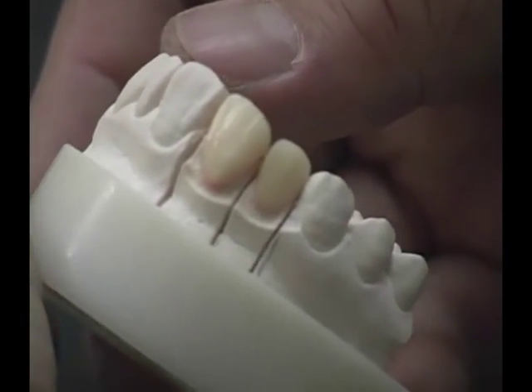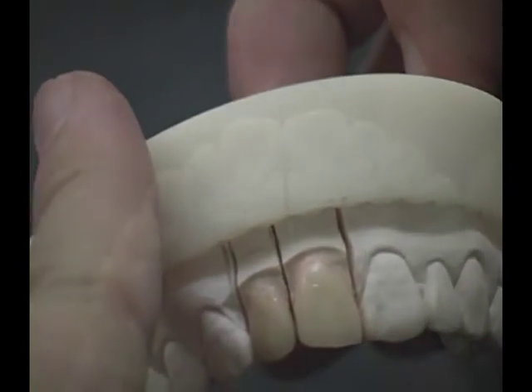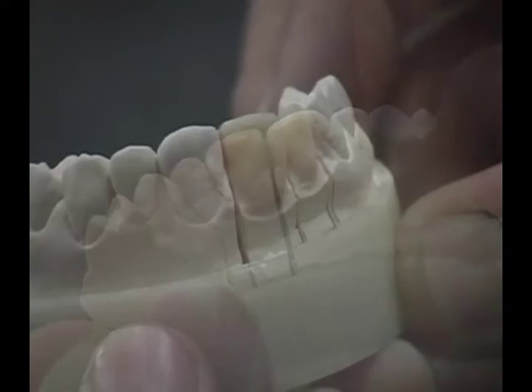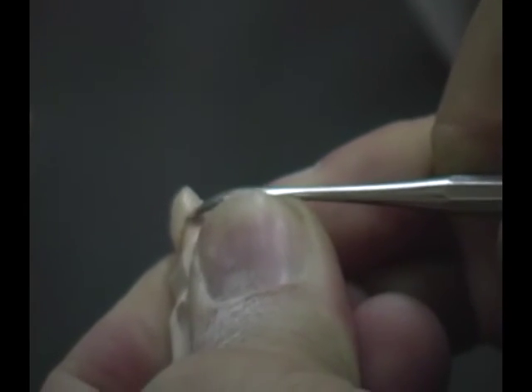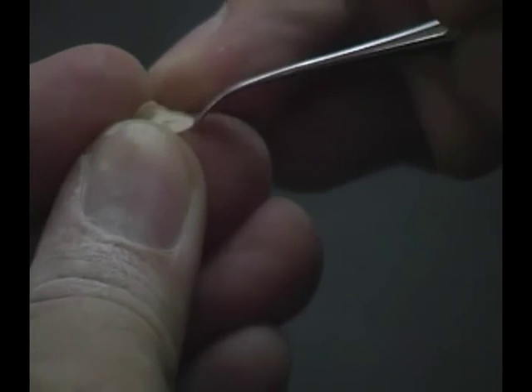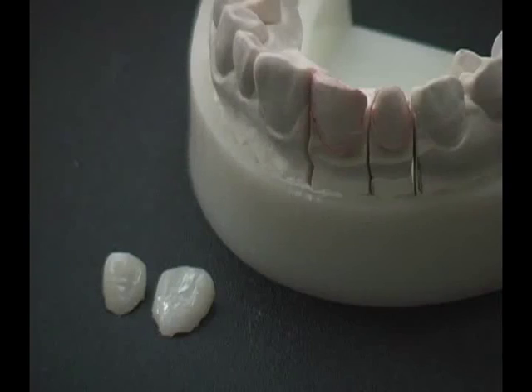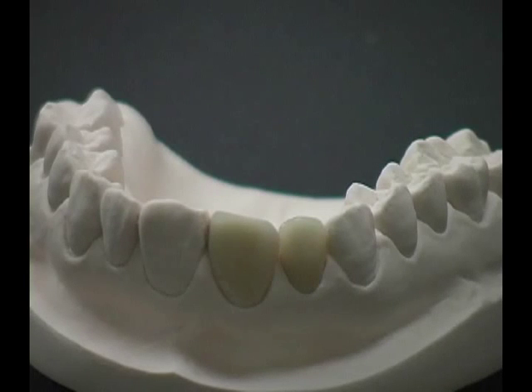It's easy to create veneers with aesthetics that match closely with natural teeth. Lever the restored veneer gently from the die and remove the spacer with a composite instrument. The veneers for the central and lateral incisors are complete and ready for placement.